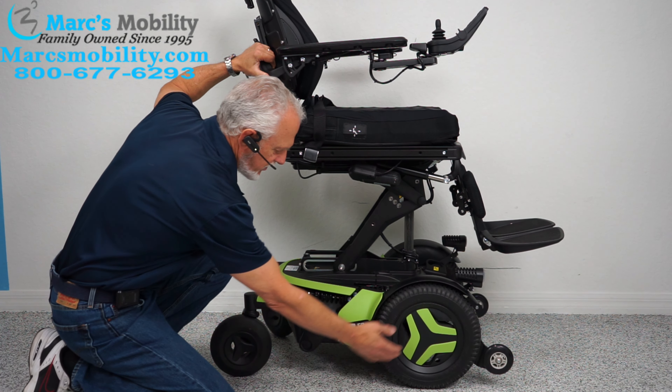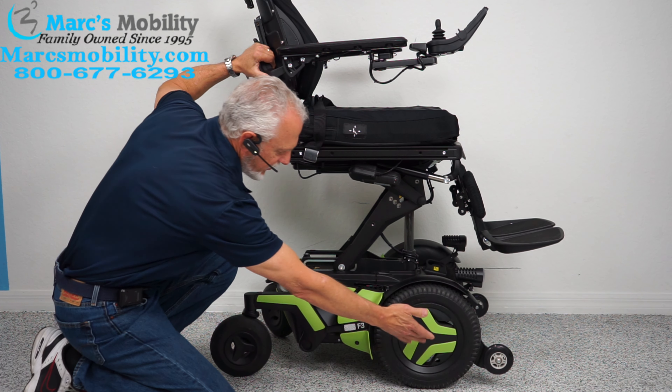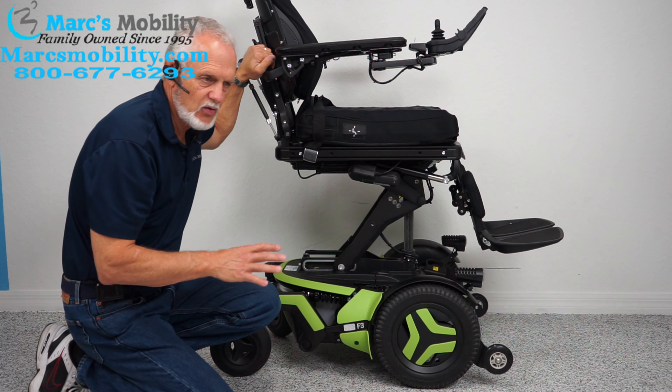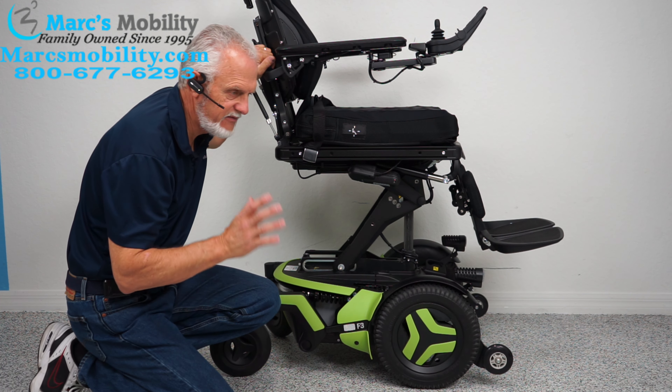You have two motors, one for each wheel. There's a motor right here that ends right here with this little lever — it goes directly to the middle of the hub. You have one on each side. This chair probably weighs around 425 to 440 pounds, so it's very heavy.